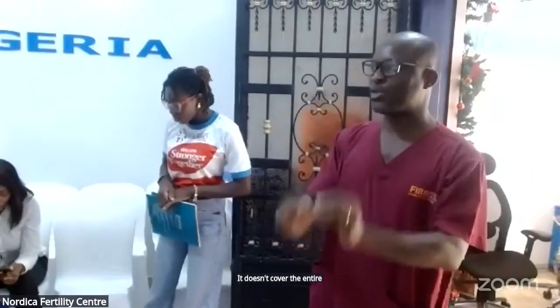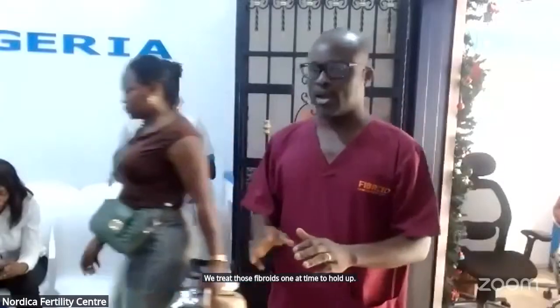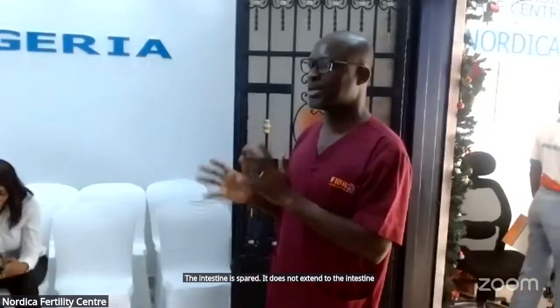We focus it on the fibroid that we want to treat, one after the other. That tells you that it only focuses on the area where you've placed the machine. So the ovaries are spared. The intestine is spared.